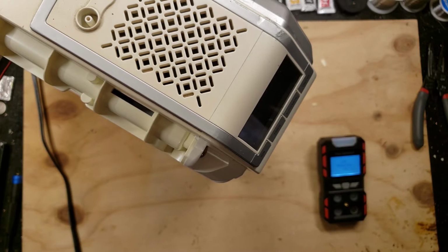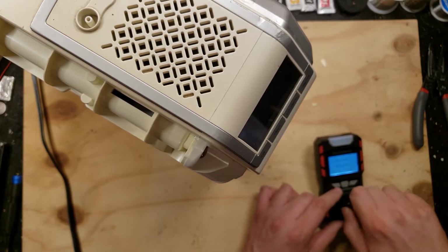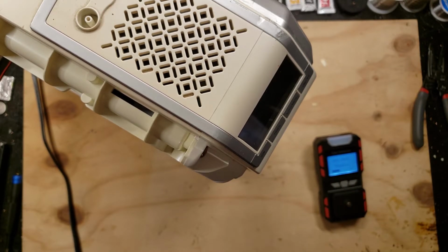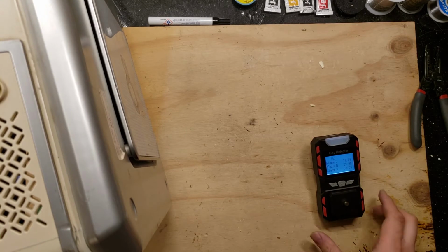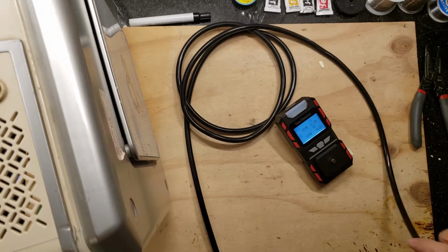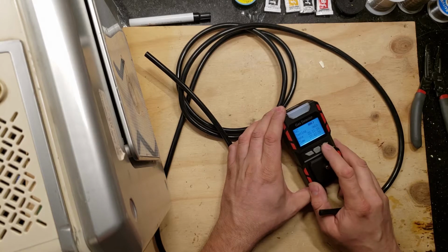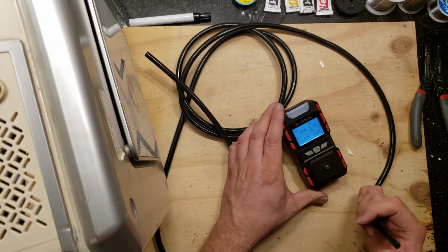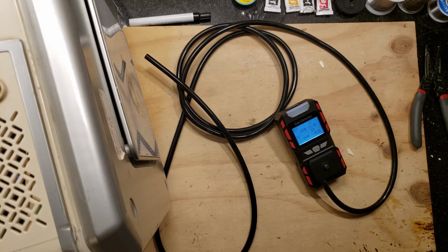Welcome to use intelligent voice gas detector. Starting. Please wait. So let's take the 4-gas analyzer and let's test it. Focus. Oh, it's not going to focus on that, is it? Until I move this. Okay. So it's going to take a second with this length of a hose, but oh, that's its screen. So oxygen is 20.2.